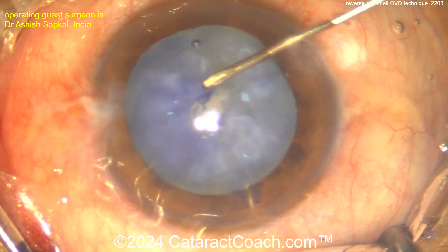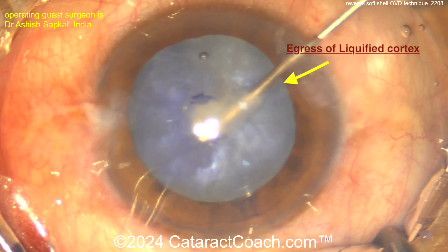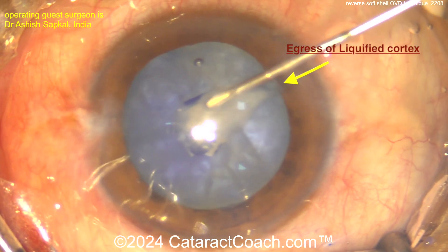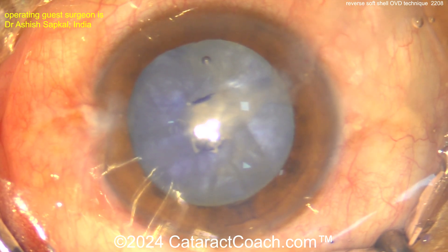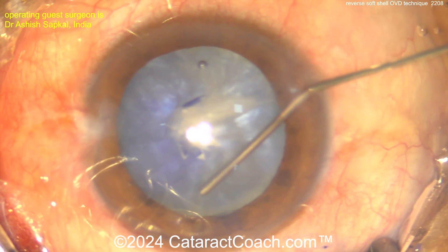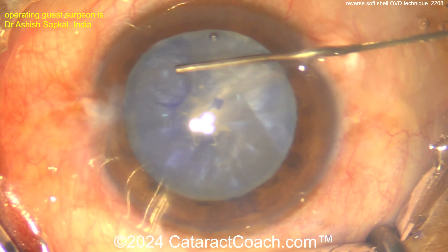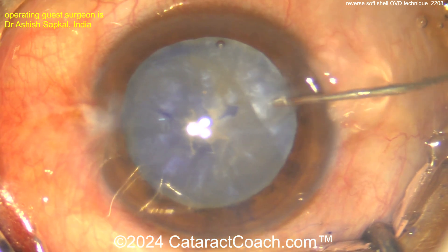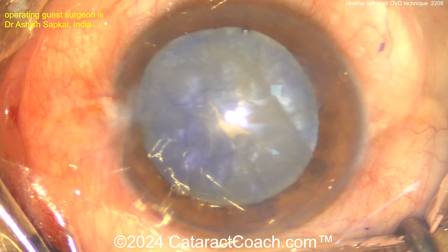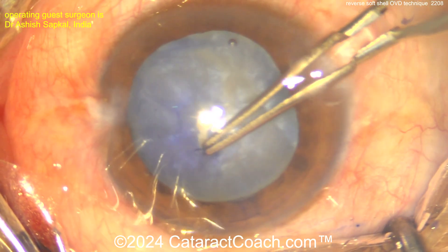It looks like a double rexis technique with multiple incisions — some egress of fluid. Look at these little relaxing incisions being made on the capsule. There's liquefied lens material leaking out, egress of that fluid. Now more cohesive viscoelastic on the peripheral part of the lens, pushing on the anterior lens capsule to help push out more liquefied lens cortex and keep that capsule nice and flat. A little dispersive agent in the center, and now the rhexis is going to be done.